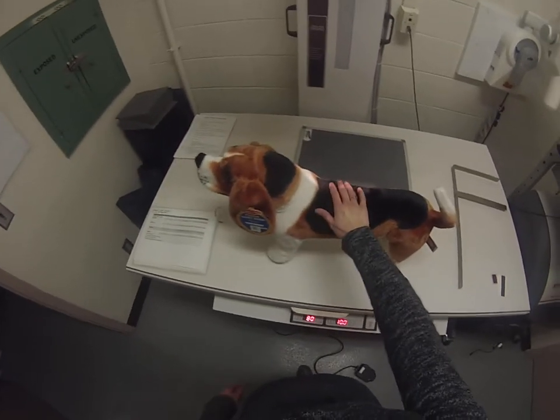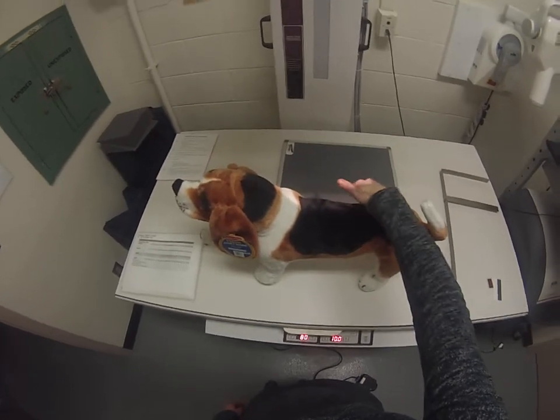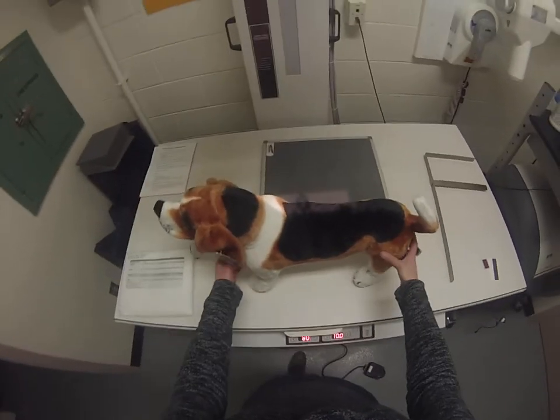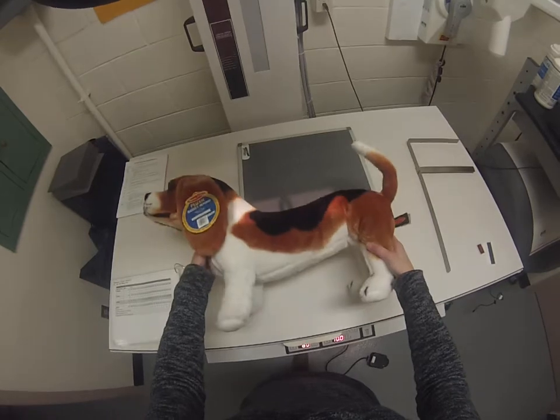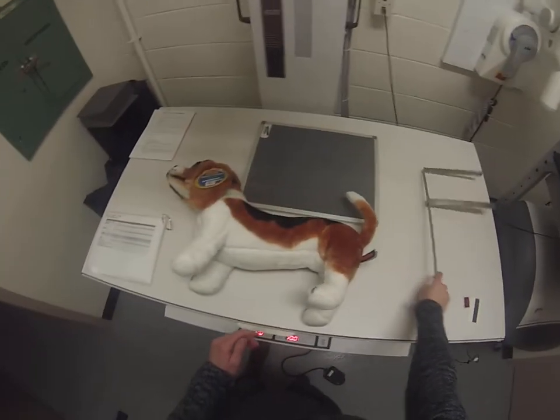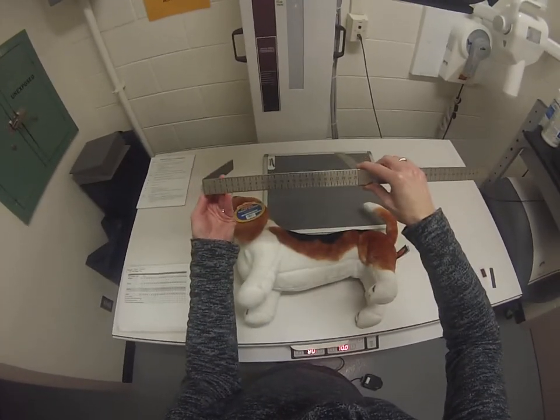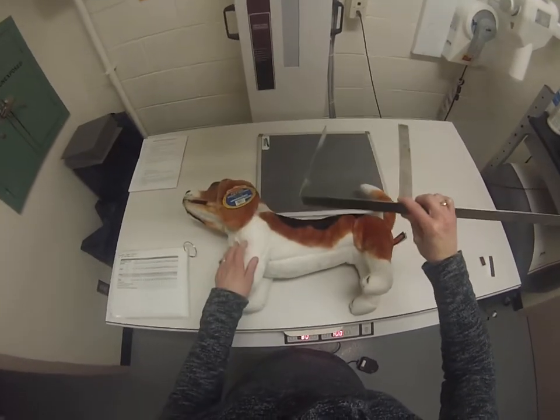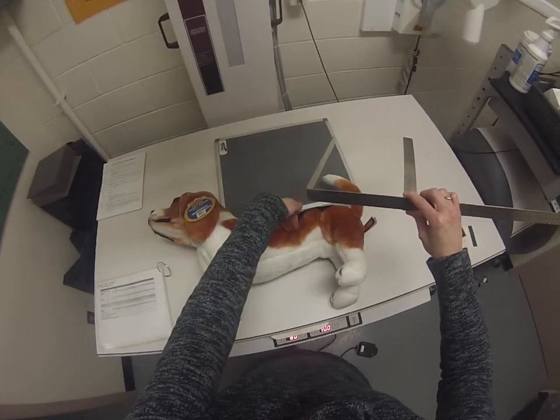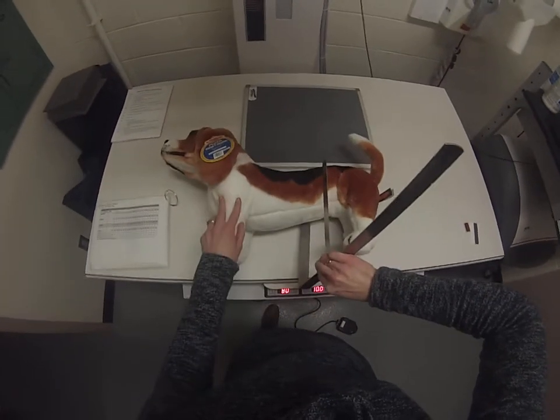On this basset hound, we're going to take an abdominal view, specifically the right lateral view. A right lateral means the patient will be lying on their right side. Ideally, you measure your patient in the position they'll be in for the radiograph, so I'm going to put my patient into right lateral recumbency. With calipers, I'm going to measure from the point of x-ray entrance to x-ray exit — the x-ray beam is going to enter this side and exit below.